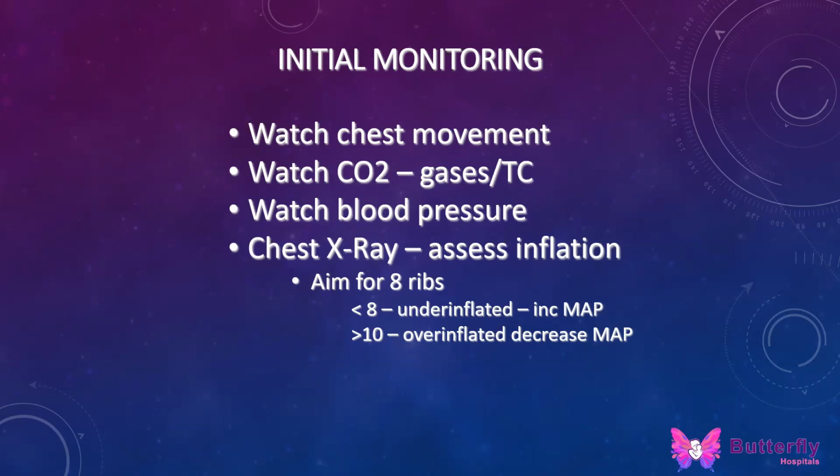And one is watching the chest wall movement, watching the blood gases, doing a chest X-ray, ideally within an hour to start with, and at least every 12 to 24 hours, to make sure that you're not under-recruited or hyperinflated.